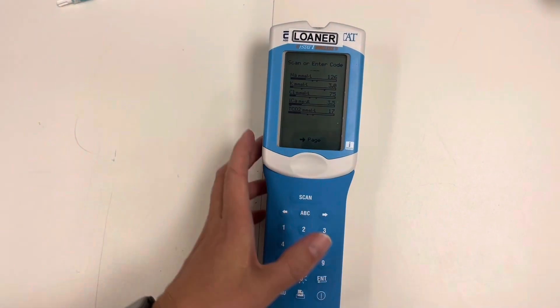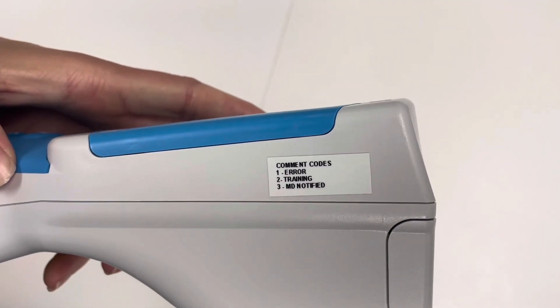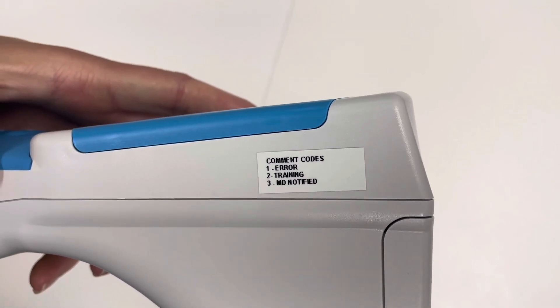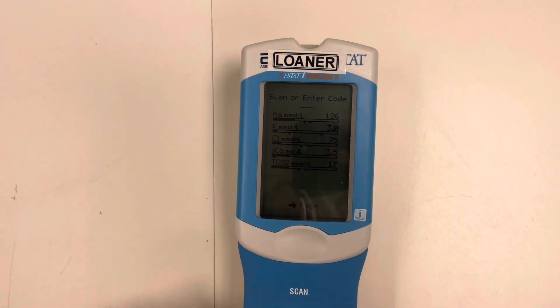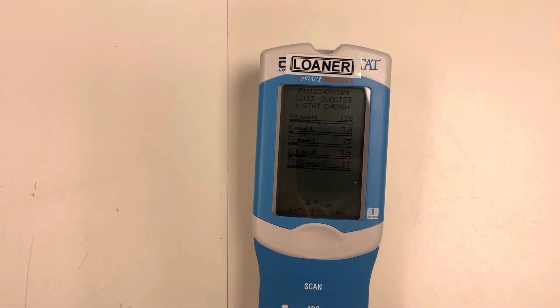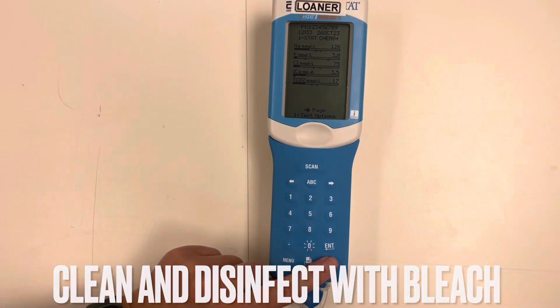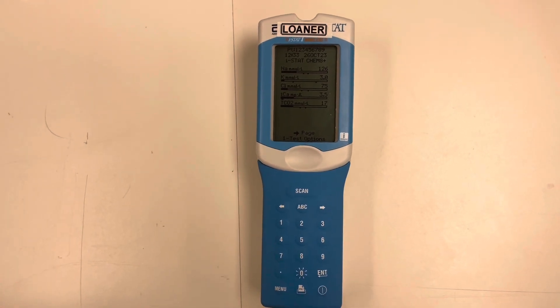Scan our enter code. As a reminder, on the side there are the comment codes: one is error, two is training, three is MD notified. Codes one and two will not put this information in EPIC; three will. Here we will go ahead and put a comment code of three and hit enter. At this point, we can power off our iStat and it will upload into our electronic health record.